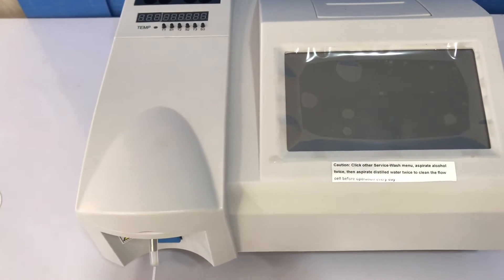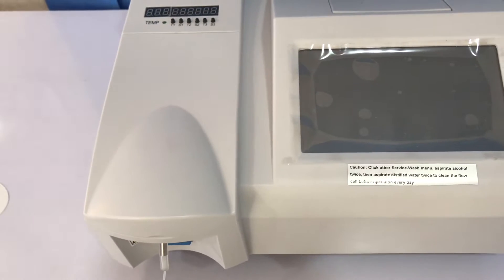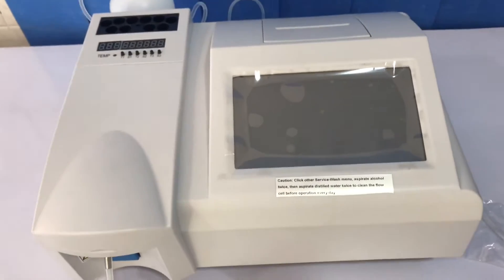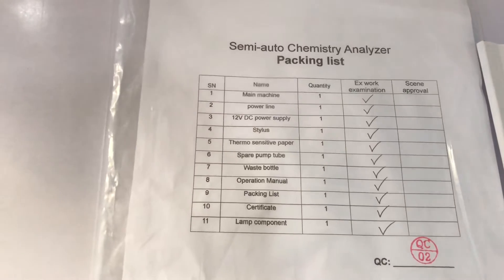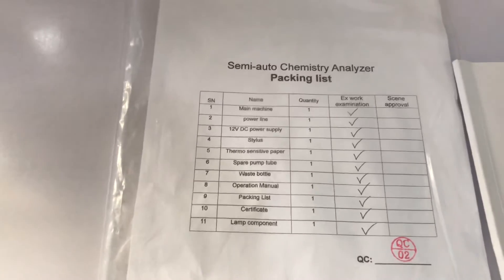Hello and welcome to a series of videos on how to use the semi-auto chemistry analyzer. When you buy this machine it comes with a packing list — a sheet of paper that tells you all the items you are to expect in the shipping you have just received.